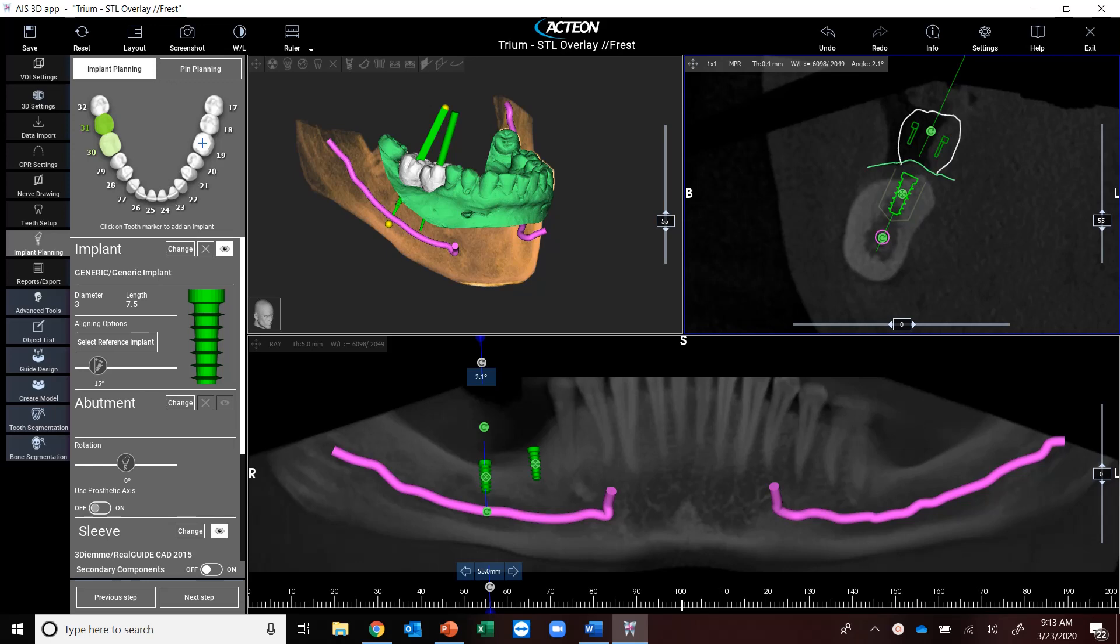It's very economical from a price standpoint and very easy to use. So as you can see, I've already planned for 31 and 30. I've got my STL already imported and plotted correctly, and then I've got a wax up in here on number 31 and 30.